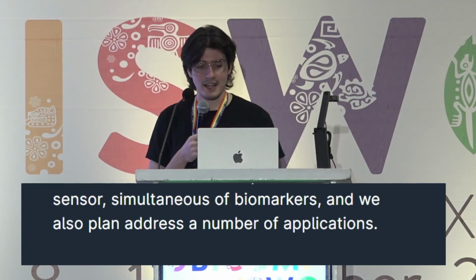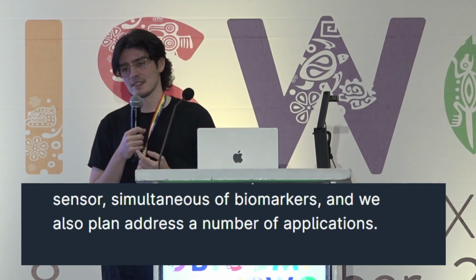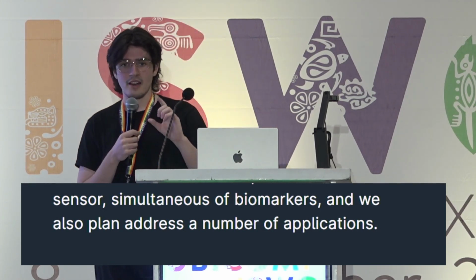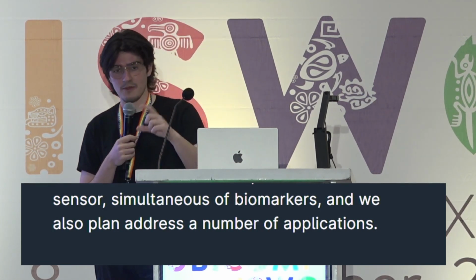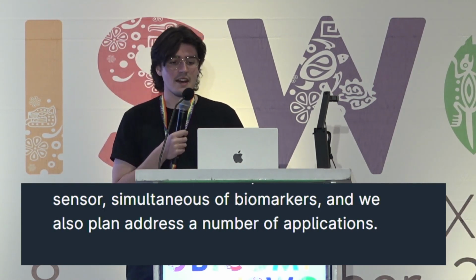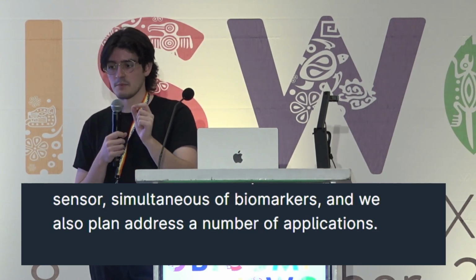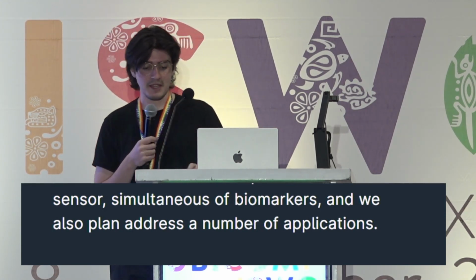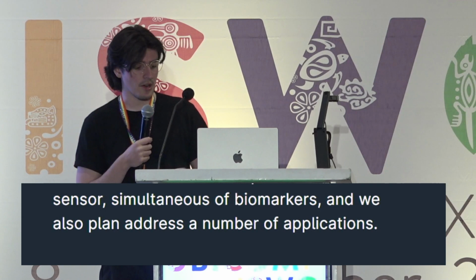So you take the phone, bring it to your forehead, leave it in contact for 90 seconds, and we extract two signals, the thermistor time series and the raw capacitive touchscreen signal. And from those raw signals, we extract further features summarizing those time series. From the thermistor time series, we get our rate of change of this linear curve for the first 90 seconds, and also the initial temperature of the device. And then from the raw capacitance, we extract the location, which is the centroid of this blob of capacitance, and the amount, which is the amount of capacitance above a certain threshold to be considered the touch area. And from that, we use these four features to create a regression model to predict temperature.